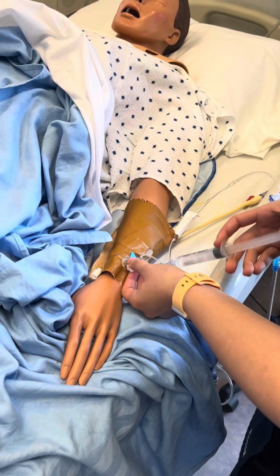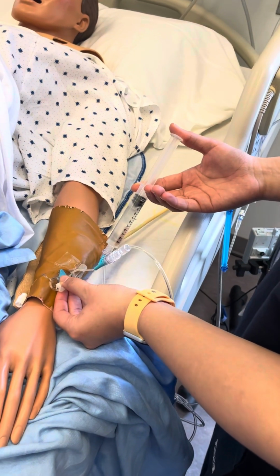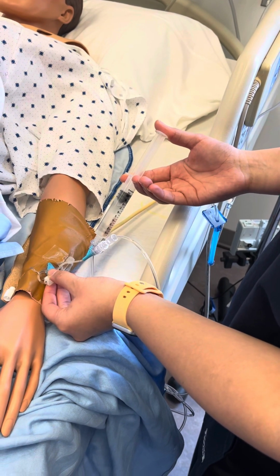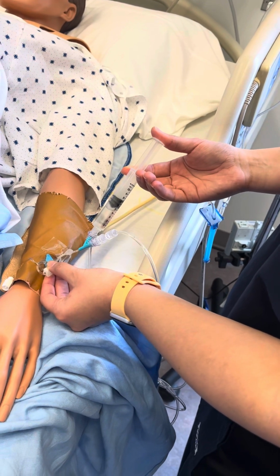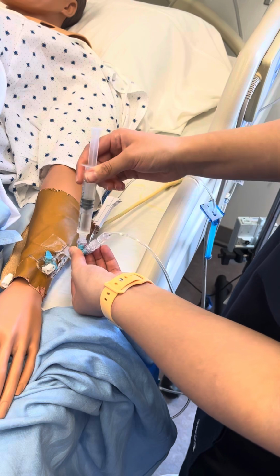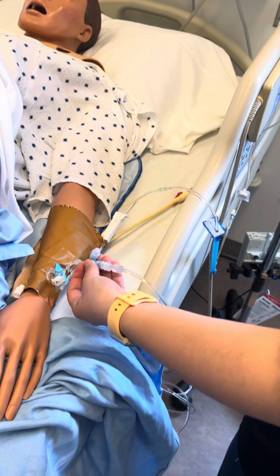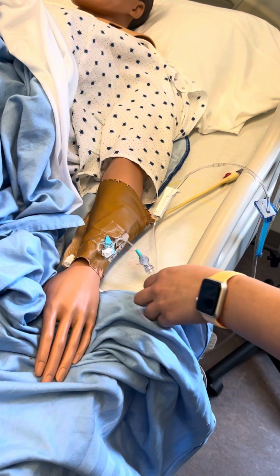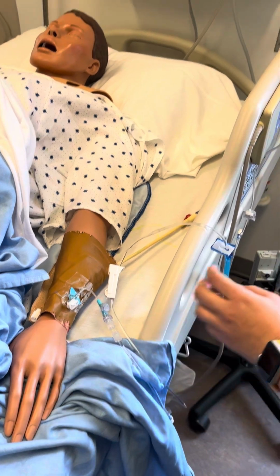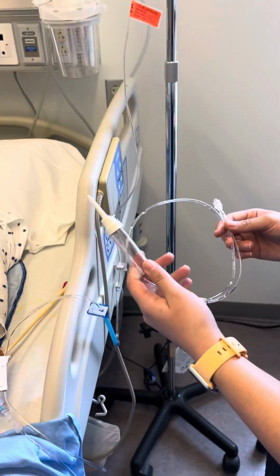I'm gonna push pause, and I want about 3 milliliters, at least. And on the last positive push, I close the clamp, unscrew, I'm done with that. So I can leave that line alone now. So next thing I want to do is get my secondary line, and then I'm going to prime that.